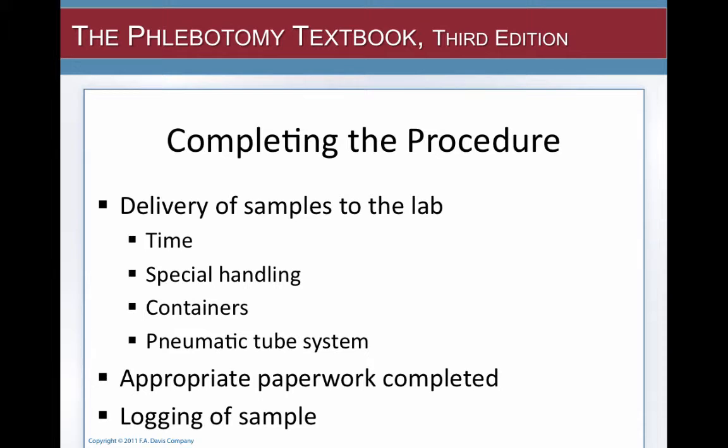Once you've completed the procedure, you want to deliver your samples to the lab in a timely manner. Some of those labs are stat, so you want to make sure they get down there so the test can be run. Some are time sensitive, so you want to make sure that you're either sending them down by pneumatic tube system on the floors, or that you're actually taking them down to the lab as needed.